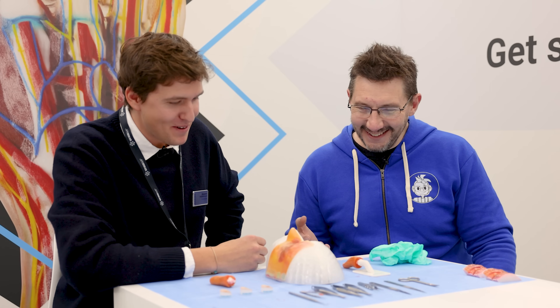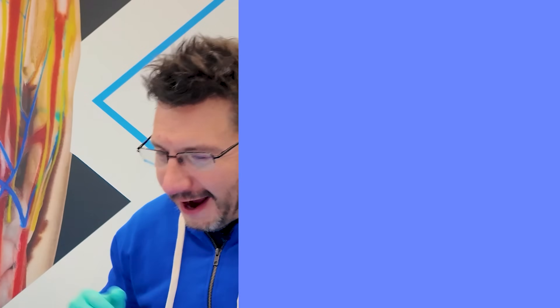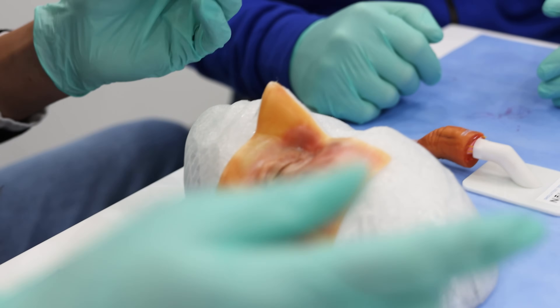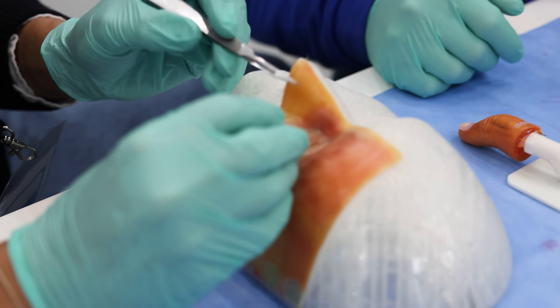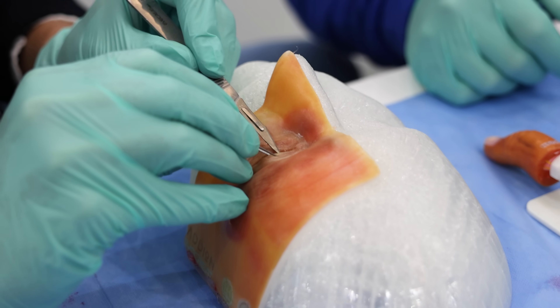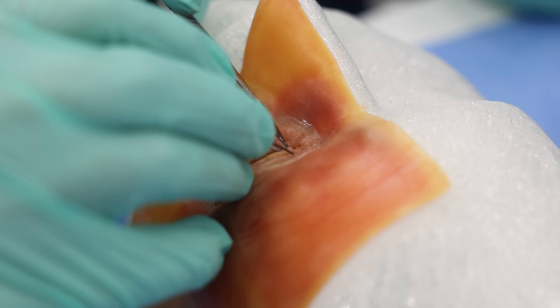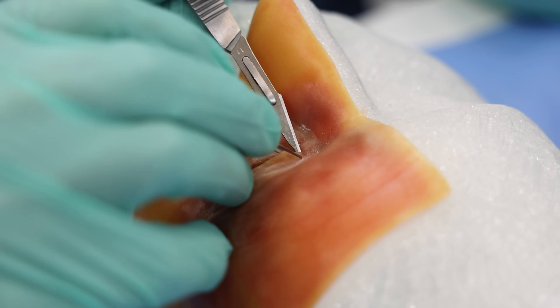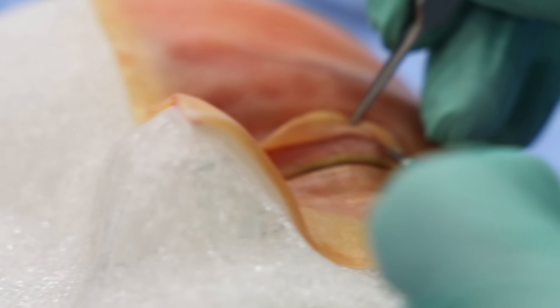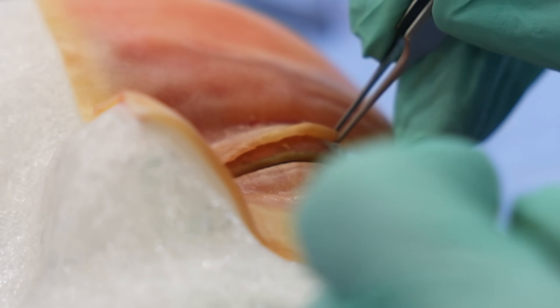With the simulation ready, it's time to play doctors. The first step is to grab a scalpel and cut open the skin - you can see everything is flexible. Cutting within the eyelid margin, you can open up the skin and see the margin of the orbicularis muscle there.